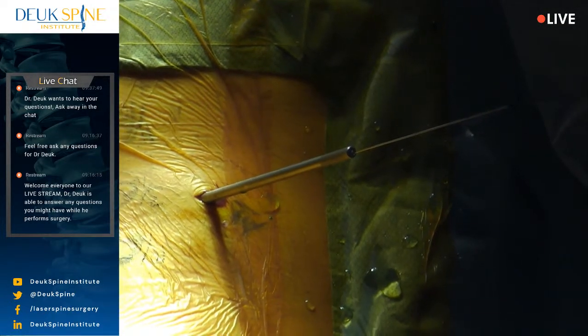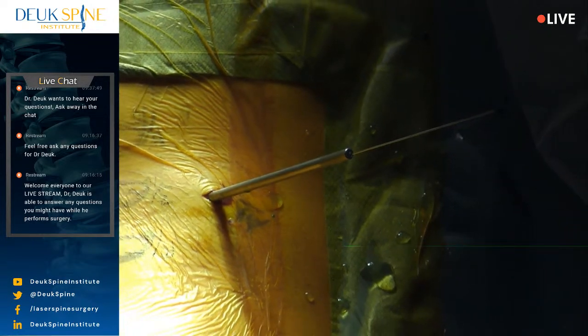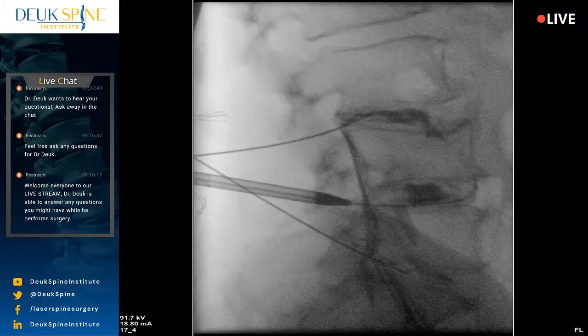All right, at this point you can see just in front of the dilator that there's dye in the spinal canal and it's running around the dura, in front of the dura, not in it, but in front of it. It's leaked out from the disc tear, but you can see how just as the dye has gone out of the disc and spread up and down the spine, so can inflammation.